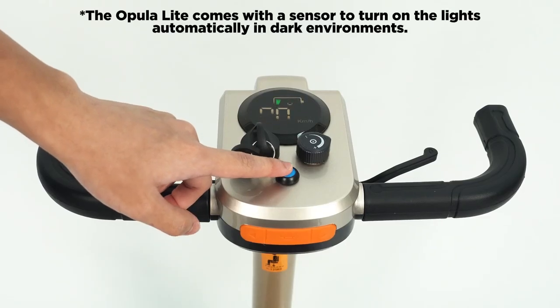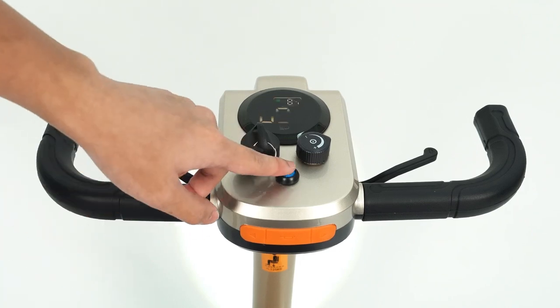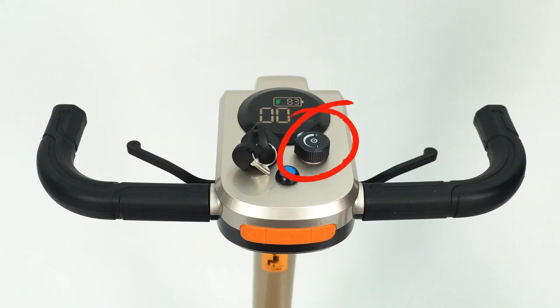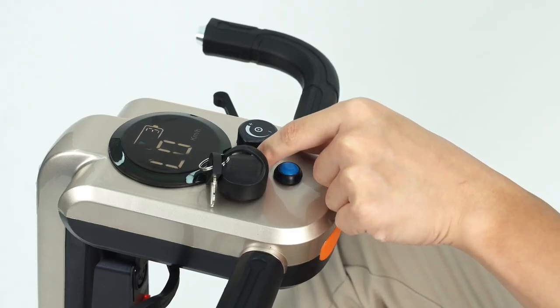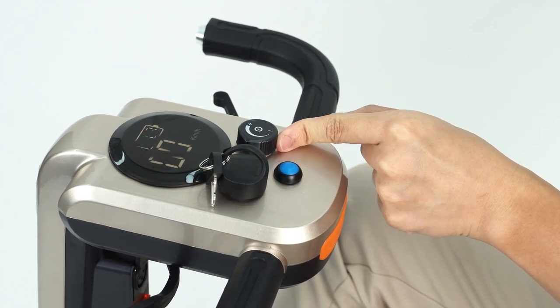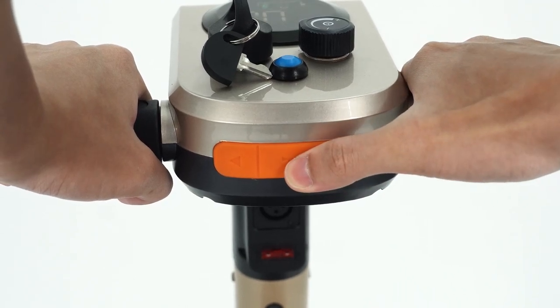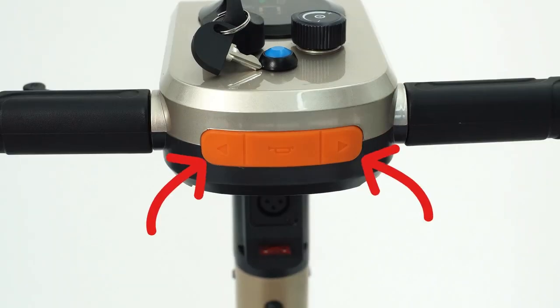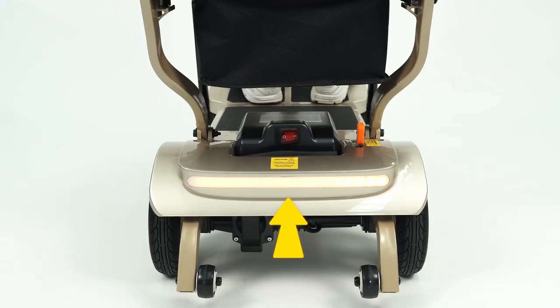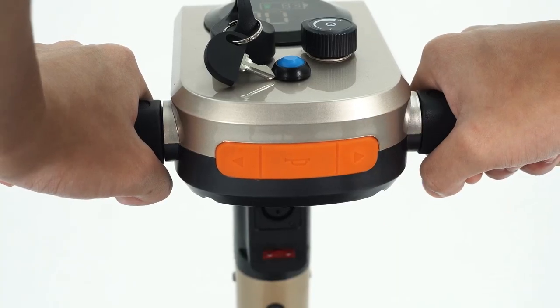Controls: To turn on the headlight, press the blue button. To turn it off, press the button again. The speed can be adjusted by the dial — turn the dial towards the plus symbol to increase speed, and towards the minus symbol to decrease it. Press the horn to alert pedestrians. There are signals on the Opila light. Press the signal button on the left to signal left, and press the signal button on the right to signal right.